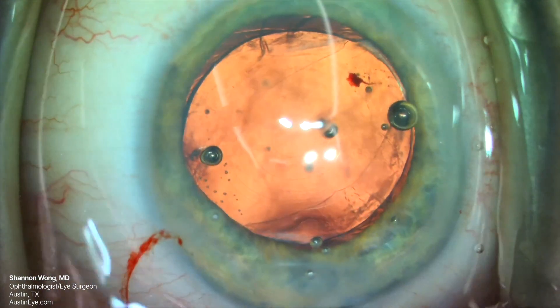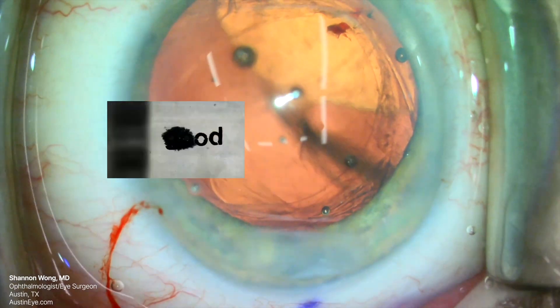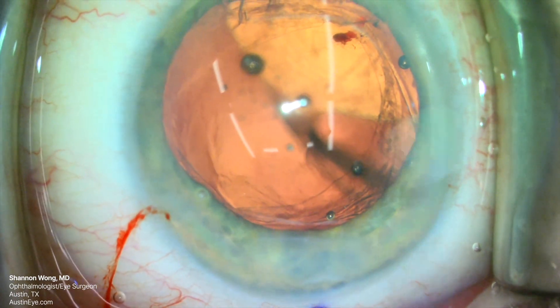Whenever I've tried I/A, even when lowering the infusion pressure to the lowest setting, I've caused dislocation of the IOL into the vitreous, which can potentially necessitate referral of the patient to our retinal colleagues.